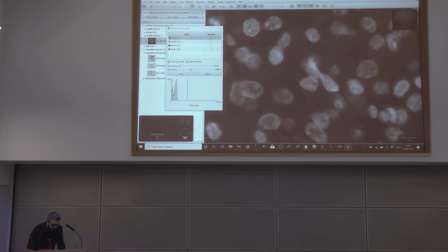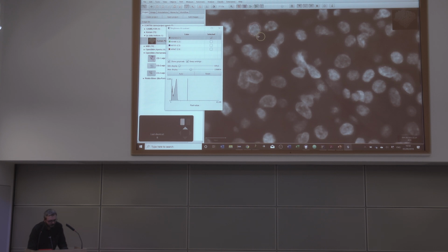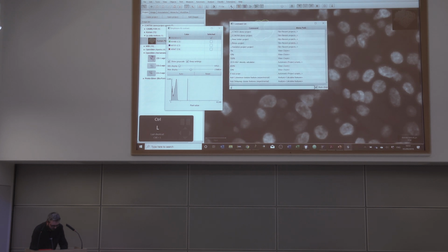So if I want to create a small region, I just zoom in. I'm going to say this is nucleus. I'm going to say this is nucleus. And I want to give it some background. But I don't want to have to draw too carefully. So I can hold down a shortcut key that prevents this overlapping with something else. I'm going to say I want it to ignore this. And then I'll train up a new pixel classifier.